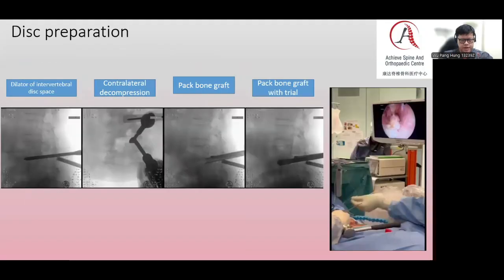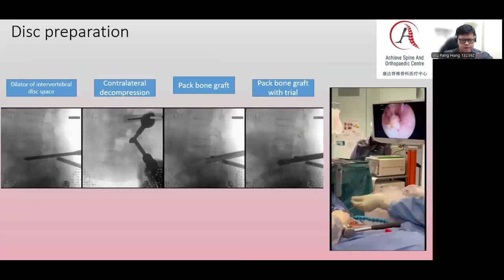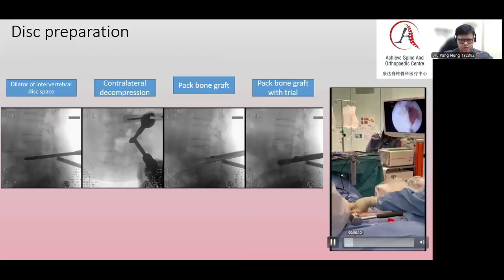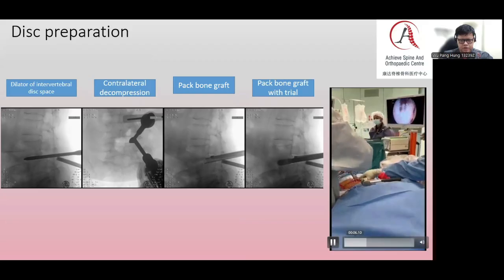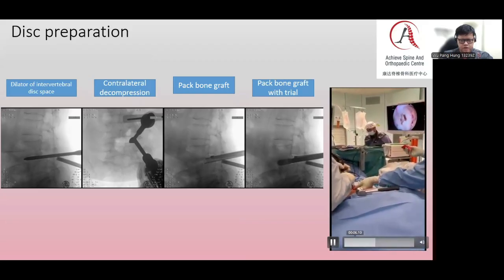This we have highlighted from the right side approach, the portal is a bit lower. The main aim is the right hand can go direct to the disc space, and then you can have an easier time to insert the cage. You can see in this surgery, you can see the disc space quite clearly, and it's pretty comfortable in doing this prep as well as that of the trowel insertion of cage.